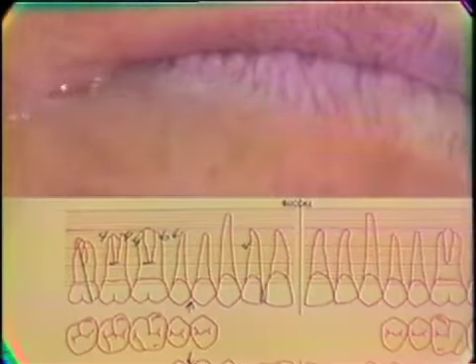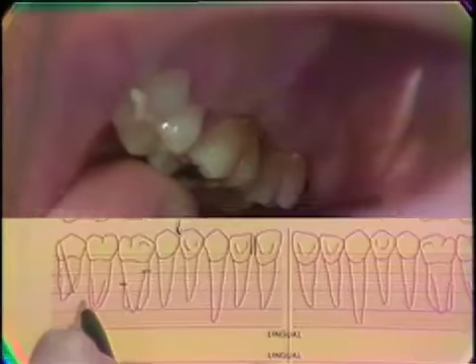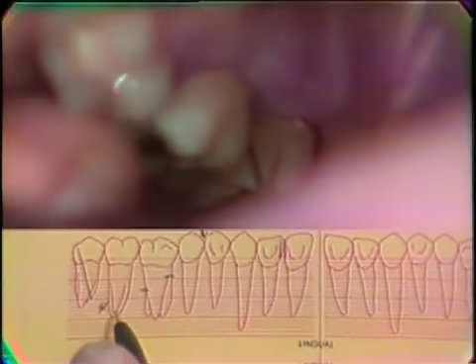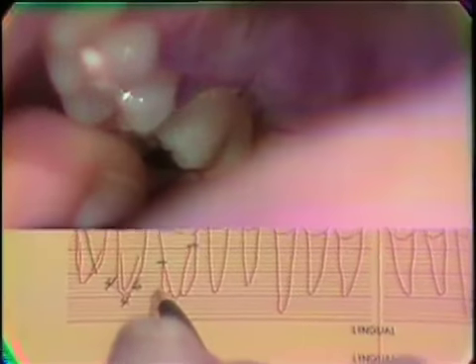I would now move to the lingual and record the lingual pocket depth, beginning with the distal lingual of tooth number 2. Turn your head toward me, please. Four, 4, 6, 6. Can you open a little wider, please?